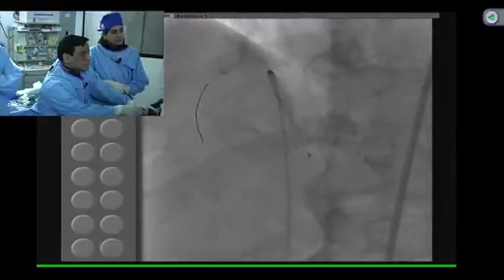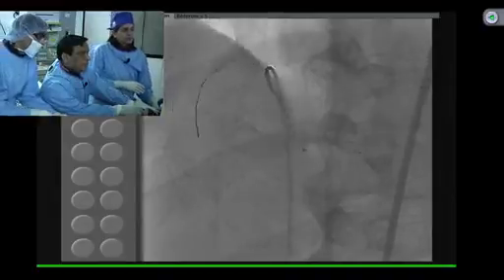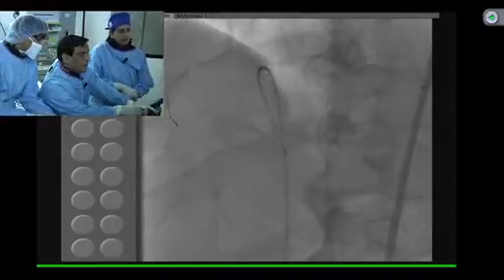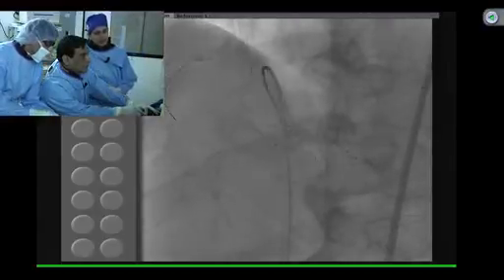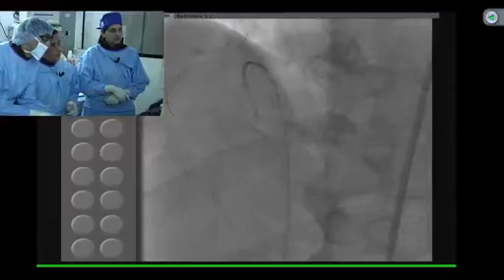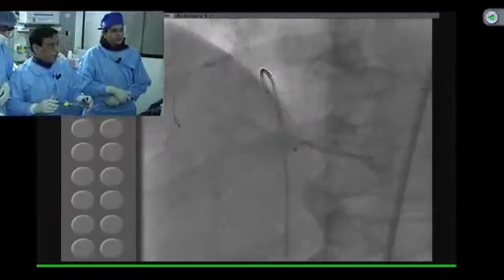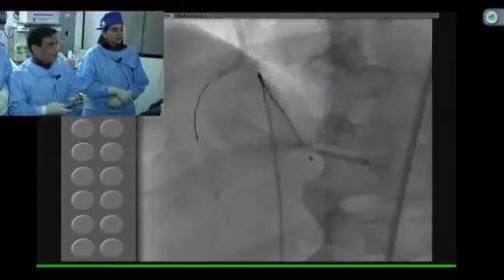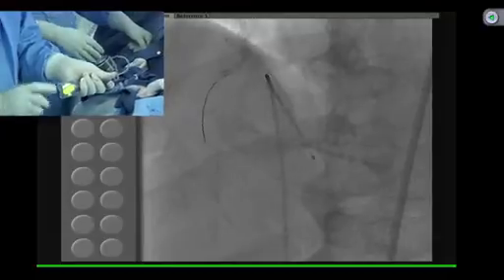With the XIENCE stent, the stent is exactly at the marker. Yep, exactly. So we are going to pull back, one second. Wait. Yeah, good. Go on. No, I think it is still half a millimeter inside. Yeah, at the marker. That's the key. Yeah, you can go, but clearly don't go beyond 12 atmospheres. So that, and 2 dilatations, and then a second, more spherical expansion.